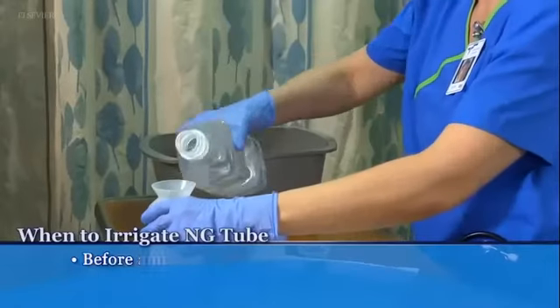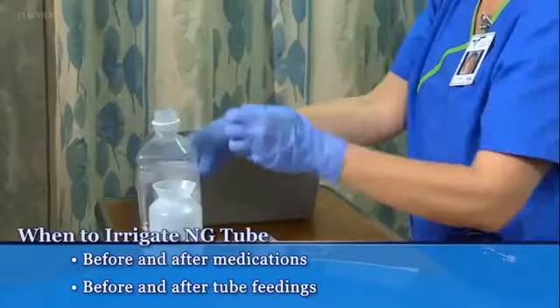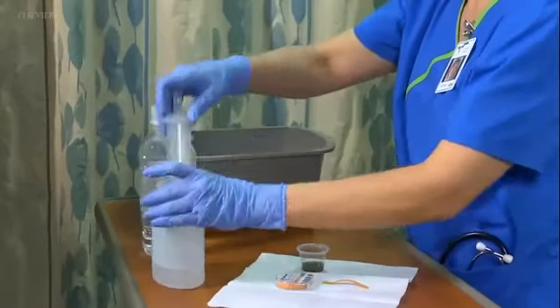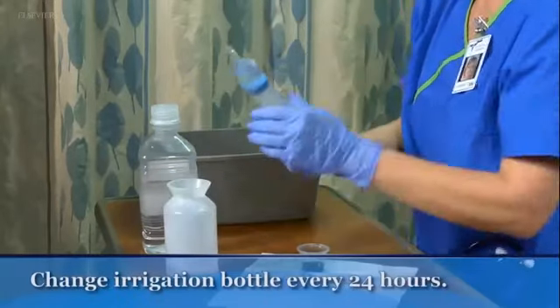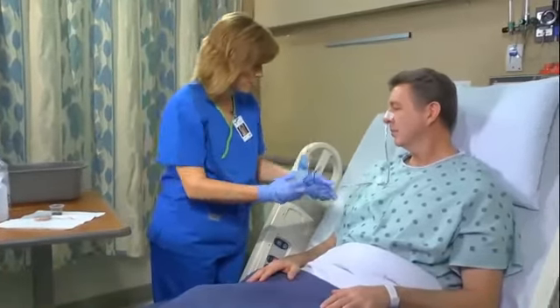Remind the patient that this will be done before and after he receives medications, and before and after tube feedings. Now, draw 30 milliliters of water into a syringe. Be sure your patient has his own bottle of irrigation fluid. Change the bottle every 24 hours. Your stomach, I'm going to go ahead and flush it for you, okay?